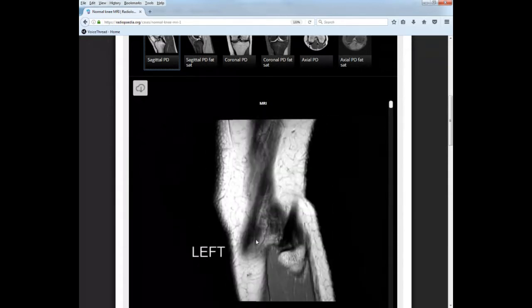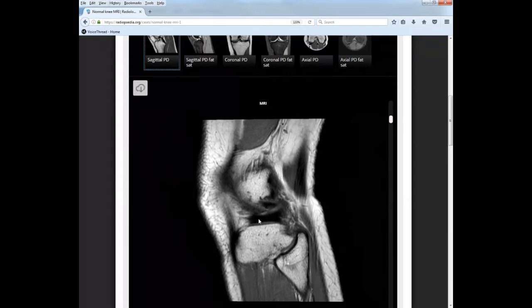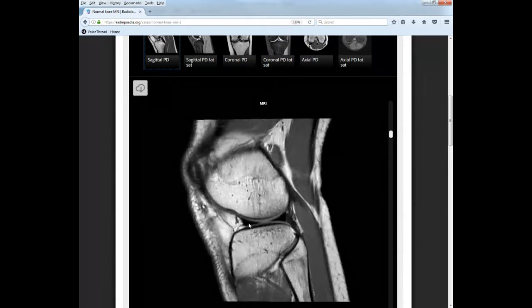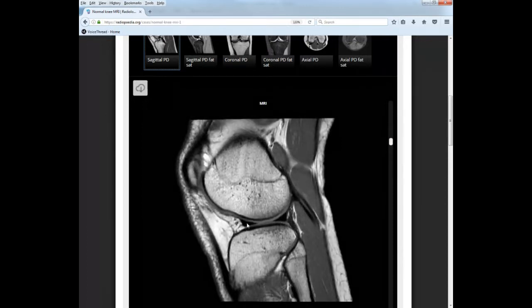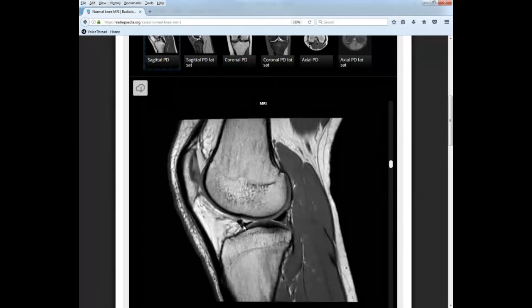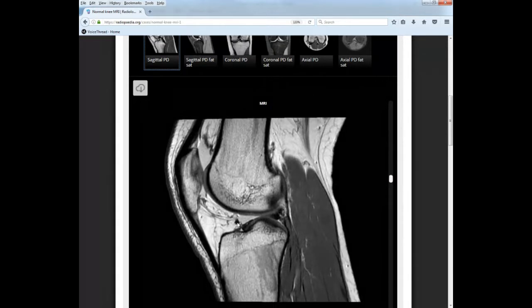All right, so let's start lateral because it's just the closest, and I know I'm lateral because there's the fibula. So as I travel into the knee, the first meniscus you're going to see is the lateral because we're on the lateral side. And so this is like the back part of the C of the lateral meniscus. As I go into the joint, I'm now going to have the posterior and anterior portions of my C. So here's your posterior horn and your anterior horn of your lateral meniscus. It's going to look like a triangular wedge in a sagittal view. So there's your meniscus, posterior horn, anterior horn, and then remember that they're connected on the anterior side by the transverse ligament, and that's this guy right here.